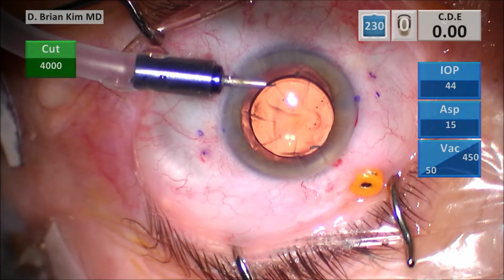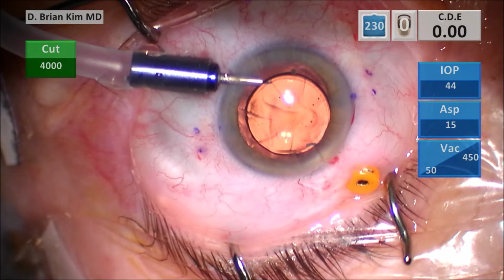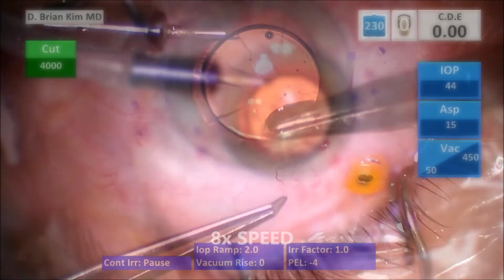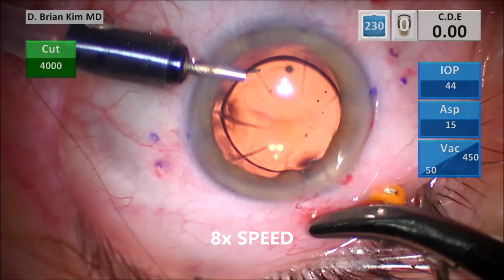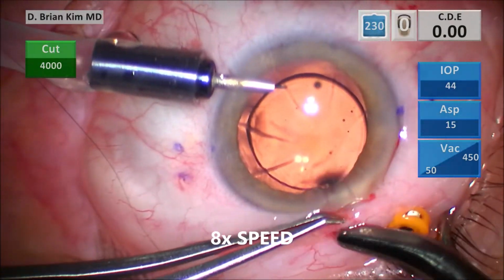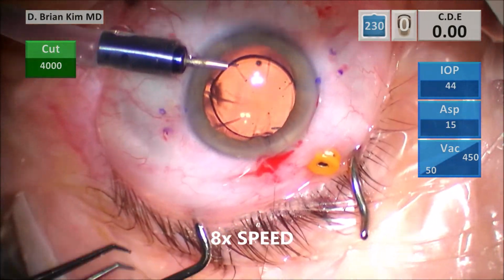I've pushed the haptic bulbs into the sclera, reapproximated the conjunctiva. Now I'm going to go ahead and place a 10-0 nylon suture through the main incision, which I always do on these cases. And then we'll go ahead and tie it off and then bury the knot.